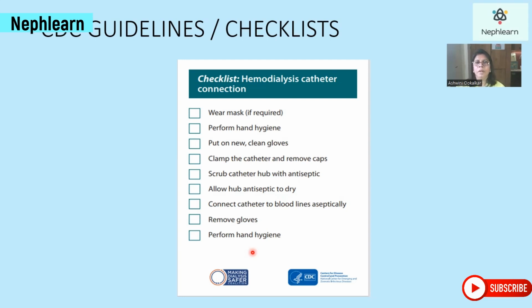I encourage people to use checklists because checklists are very, very essential in critical areas. And handling a catheter is one of the critical areas. A very fine example of using checklists is the airlines. In an airline, when you enter the plane, every flight that you take, and there may be thousands of flights per day, you are reminded to put on the seat belt, to open the window covers, where the oxygen masks are, and what to do in case of an emergency. Why do you think, by now we all know it, right? We know how to put on the seat belt, and we know where the oxygen is going to come down and what to do when they say evacuate, evacuate, evacuate. But this simply means that we need to be reminded of these things.